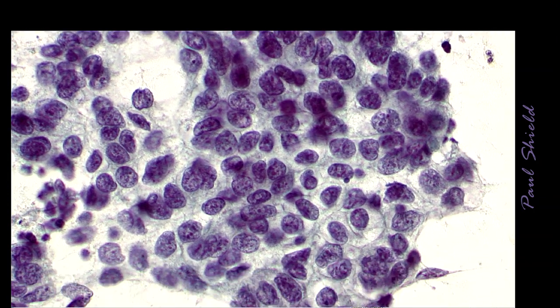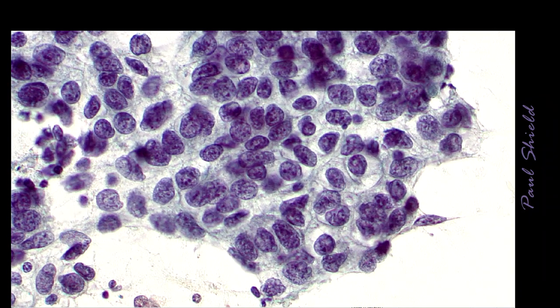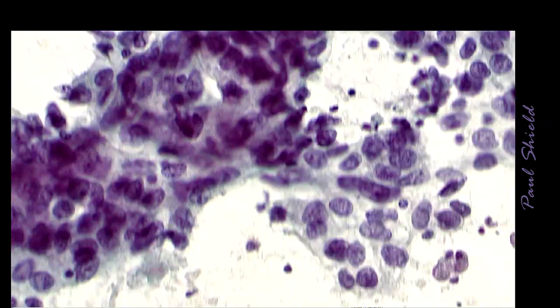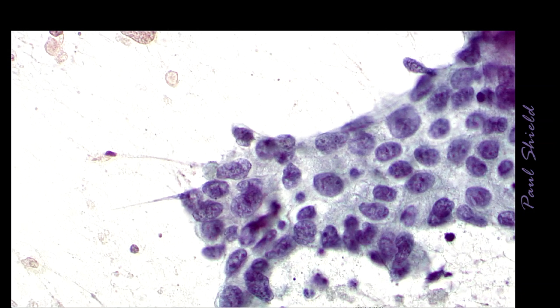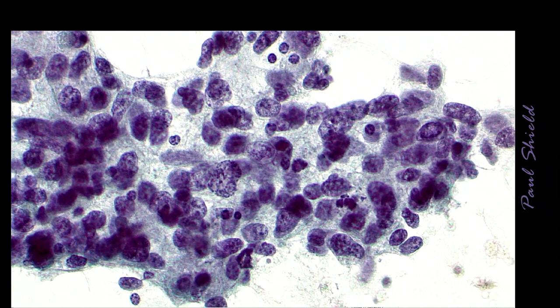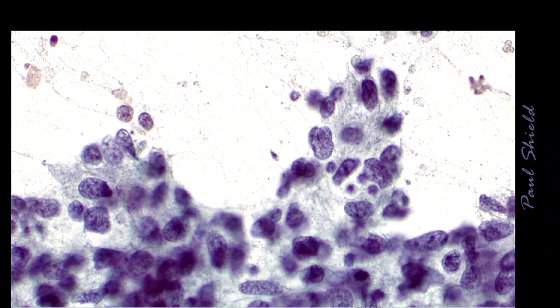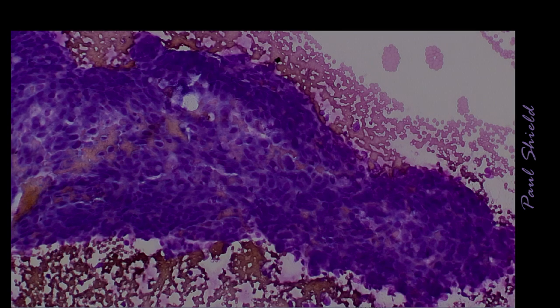They have fairly granular vacuolated cytoplasm. Nucleoli aren't as prominent in this one, but there's obvious abnormal chromatin. And again, that sort of crowded sheet. Quite a lot of variation in size and shape. In FNA you have better preservation, so you'll have better nuclear detail usually.